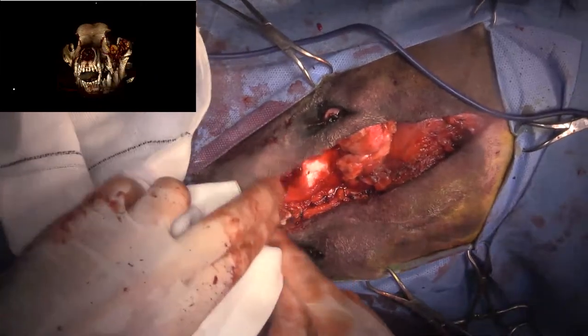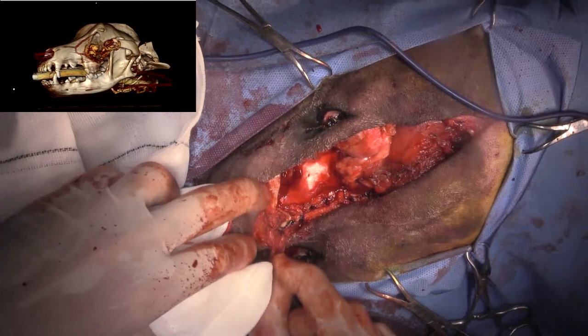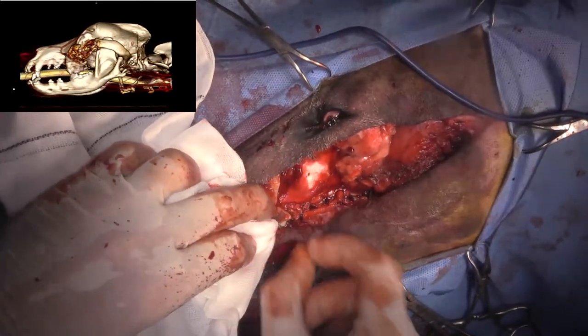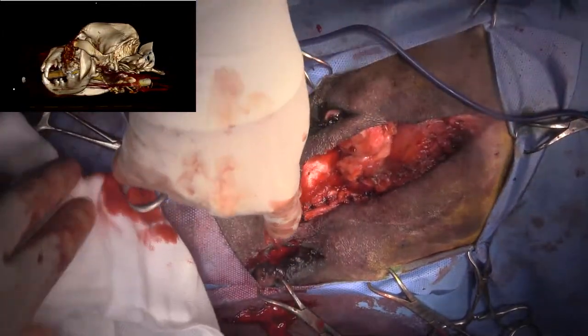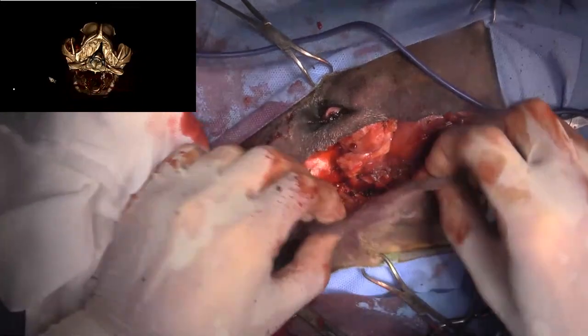Yep. Going to put it in from the outside. Yep. Beyond the wire collet. It's going to drill a little hole right there to anchor some tissue up over that tooth. Mm-hmm. And he's a premolar, so you should be able to go right between, if you wanted to, right between the roots. Yeah.